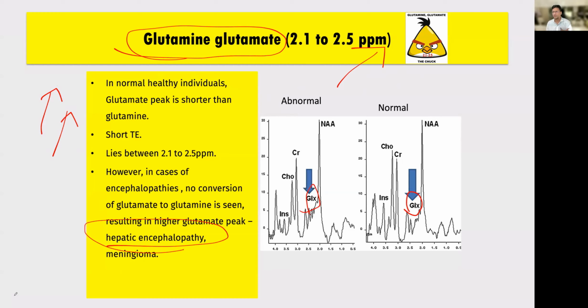And to be honest, I have not really worked on it, and I have not really shown interest in picking up glutamine in hepatic encephalopathy. Because it's more obvious, you will get the T1 hyperintensities, and you are already happy that you have diagnosed hepatic encephalopathy, and there is no point in going and doing an MR spectroscopy. If there is an indication, if somebody asks, I would have done it. But I didn't get a real indication.